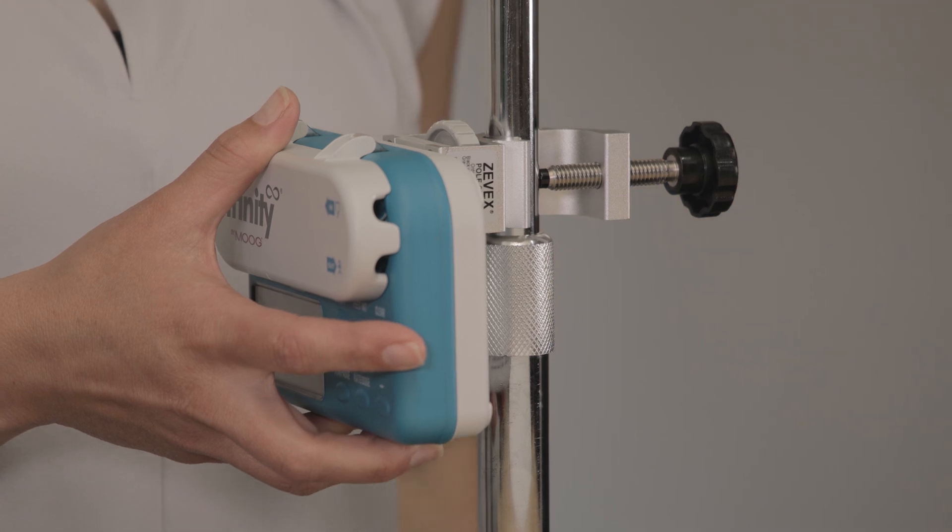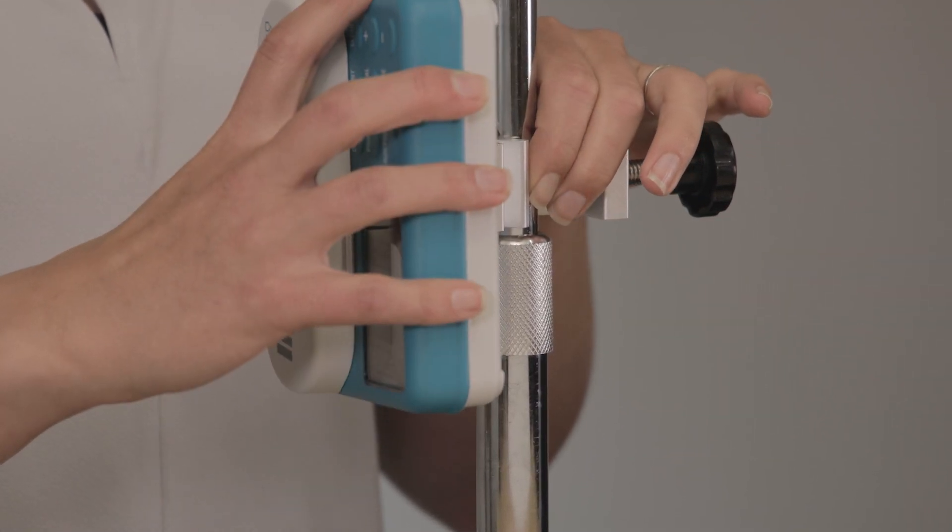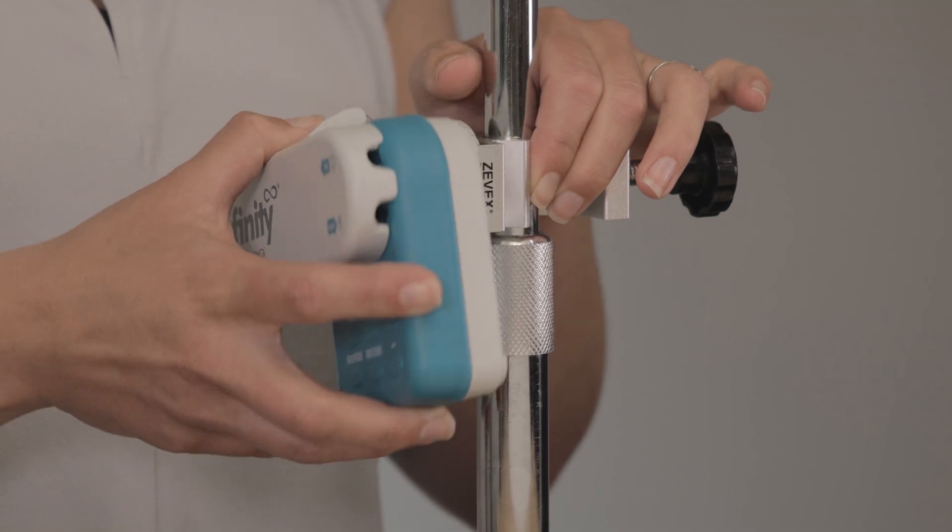If the pole clamp knob is slightly loosened, the pump can be rotated into different positions. Retighten the knob when the pump is in the desired position.